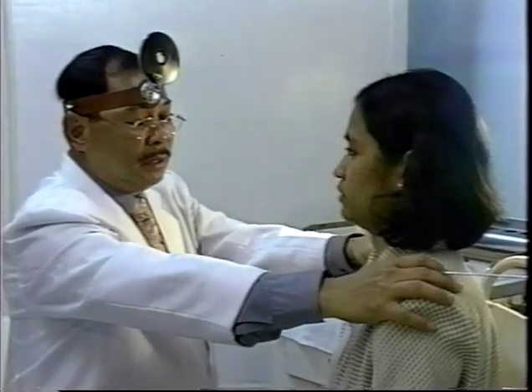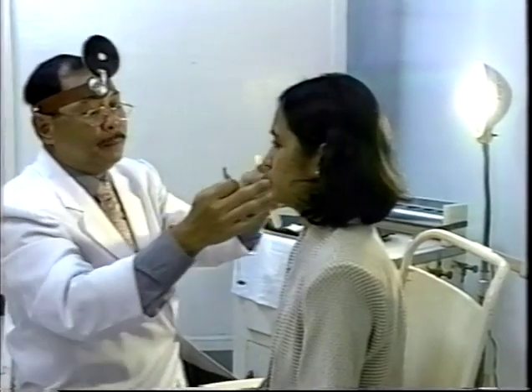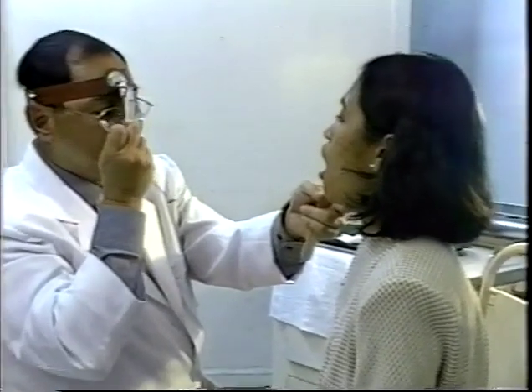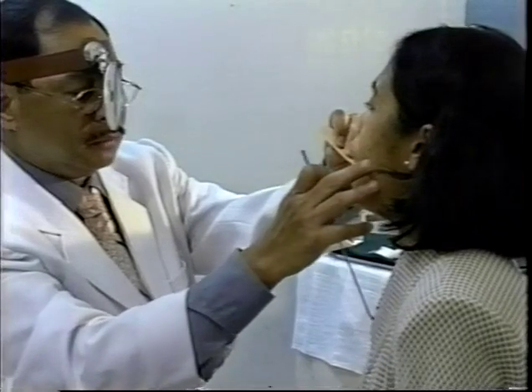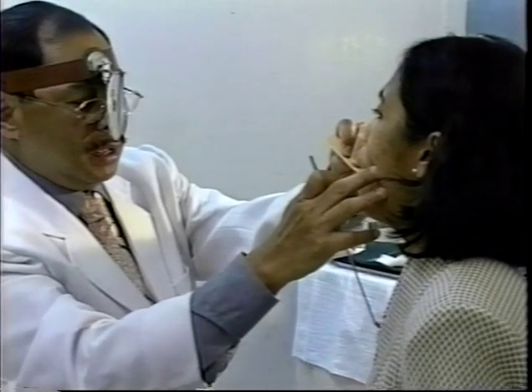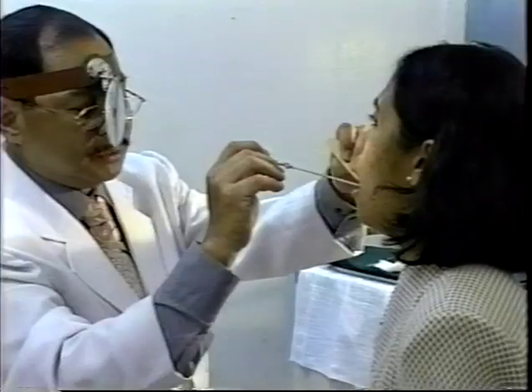This is how we do our posterior rhinoscopy. The patient is seated in a relaxed manner. The mirror is heated and tested for its warmth. The patient is asked to open the mouth, and the head mirror is focused in the oral cavity. The tongue is depressed and the patient is asked to breathe through the mouth initially, then through the nose. The mirror is inserted in the oral cavity behind the uvula, and the posterior choana and nasopharynx is visualized.